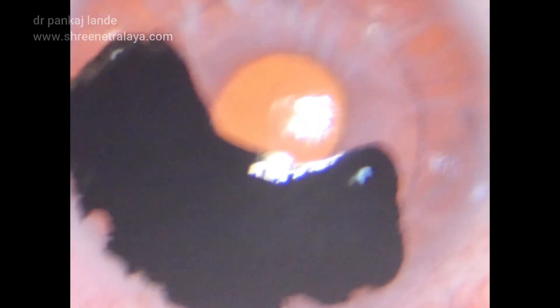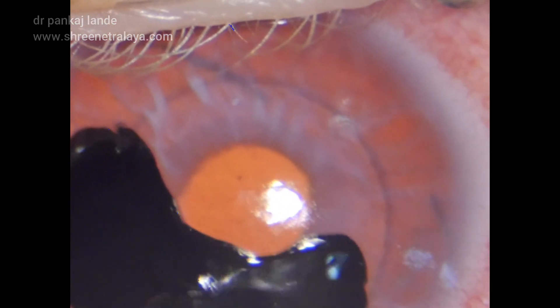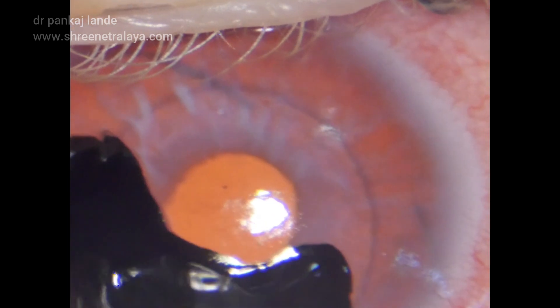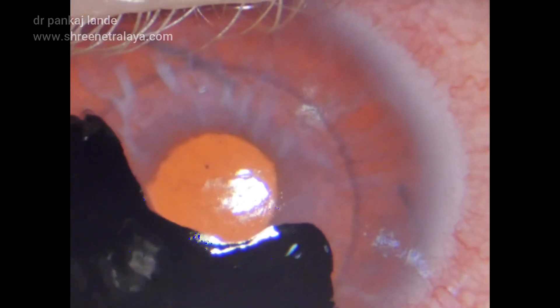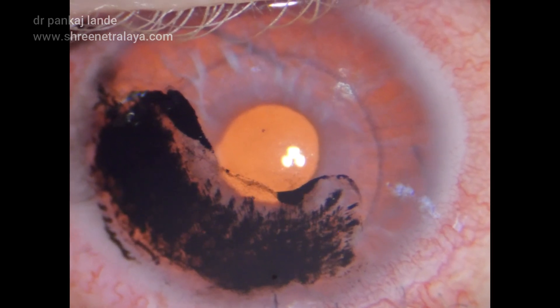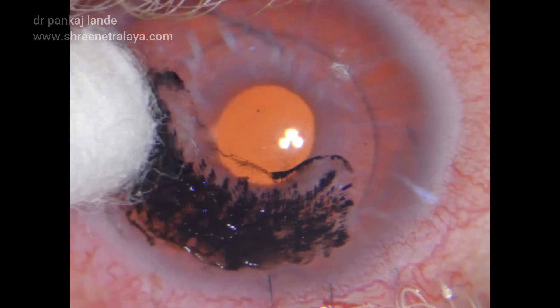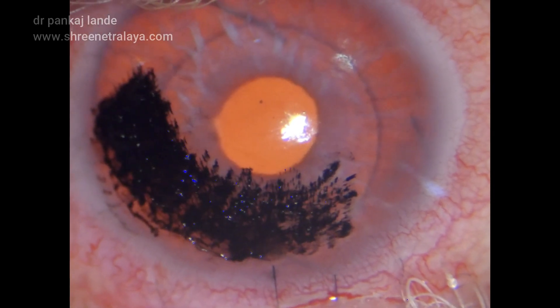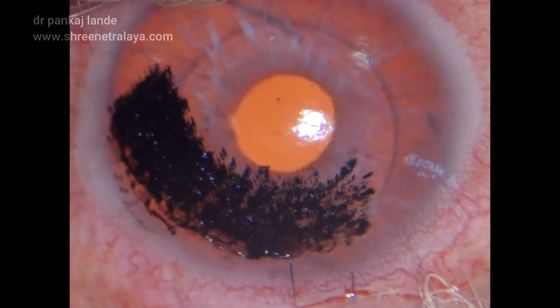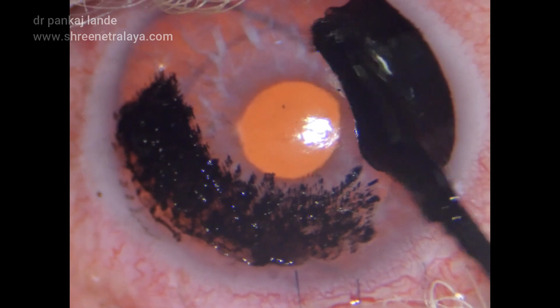As this is an irreversible procedure, we need to inform the patient about the change in color of his eyes and explain that the procedure cannot be reversed. Over years, I have noticed that the tattoo fades a bit but not much. In most cases where it has entered into the mid stroma, there is hardly any fading of the tattoo ink. So we need to be careful not to overdo the treatment — if it is underdone, it can be repeated after a few weeks.